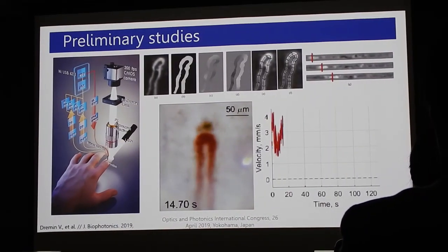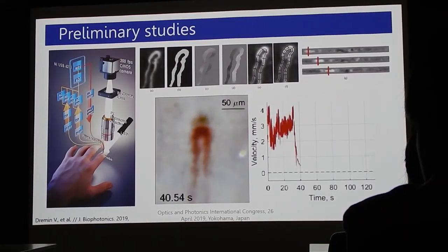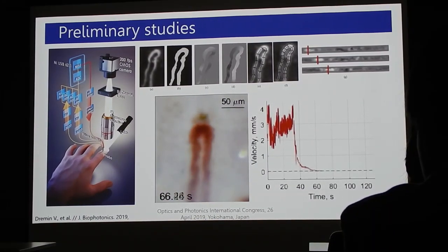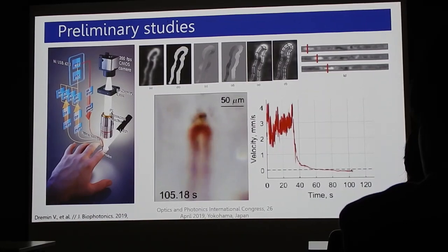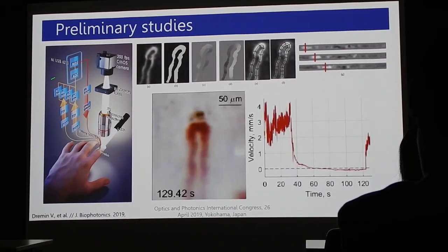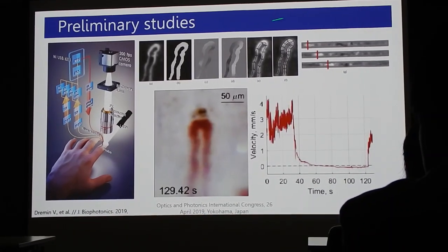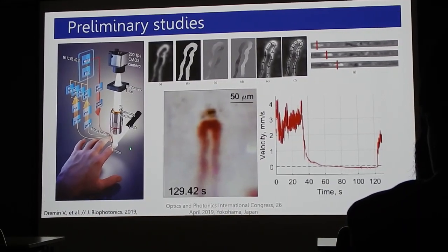Additional preliminary studies have been conducted, aimed at comparing the signal recorded by Doppler Flowmetry from a tissue volume of 1 to 3 millimeters with the signal of blood velocity from a separate capillary recorded by the method of high-speed video capillaroscopy. For these measurements, a video capillaroscopy system has been developed with original software, which allows evaluating the blood flow velocity in a single capillary. And here you can see the results.